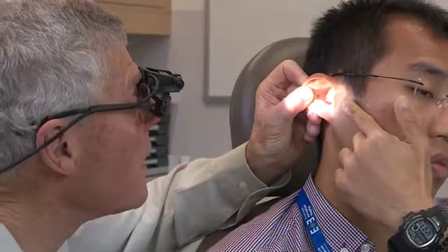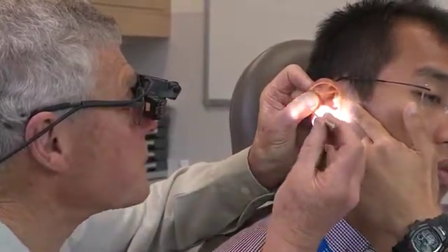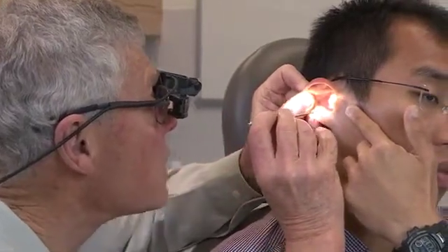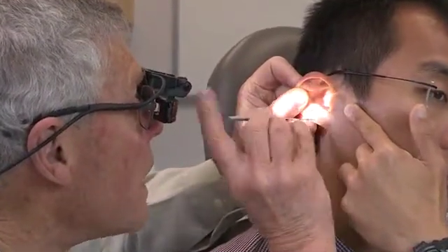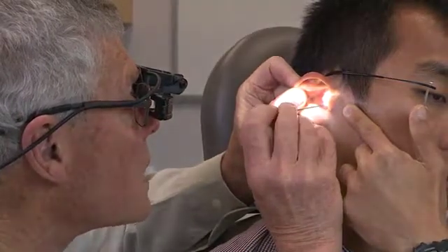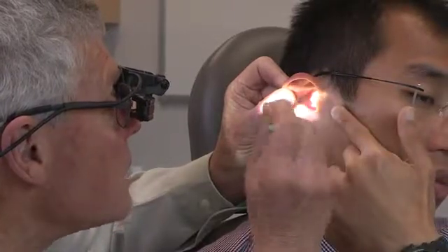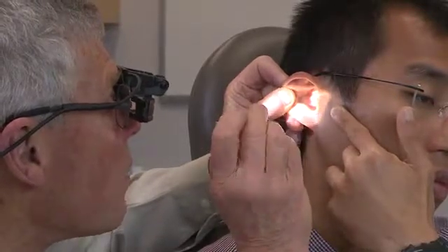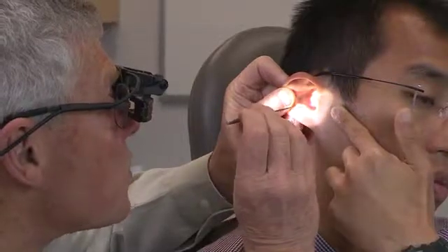And that will give me the best view I can get without a speculum. The other things that matter are: this has got a short handle, because you can see better if your looking gear lets you get closer. A long handle will stick you in the eye — will get too close to your eyes. You hold it like that, not like this, because if you're holding it like that and trying to look, your fingers stop you seeing. It won't matter always, but it matters if it's at all difficult and the ear is small — it certainly matters.